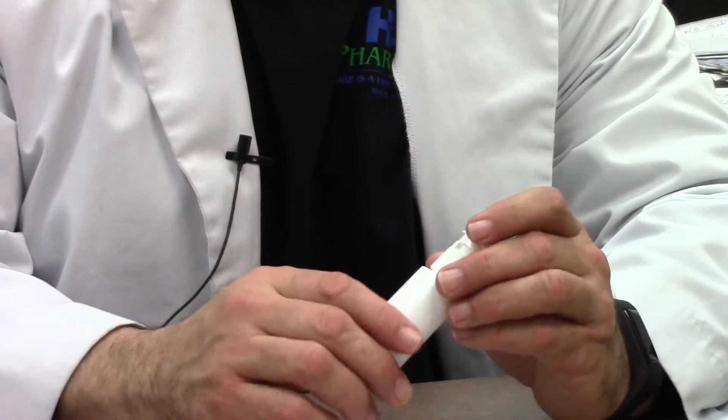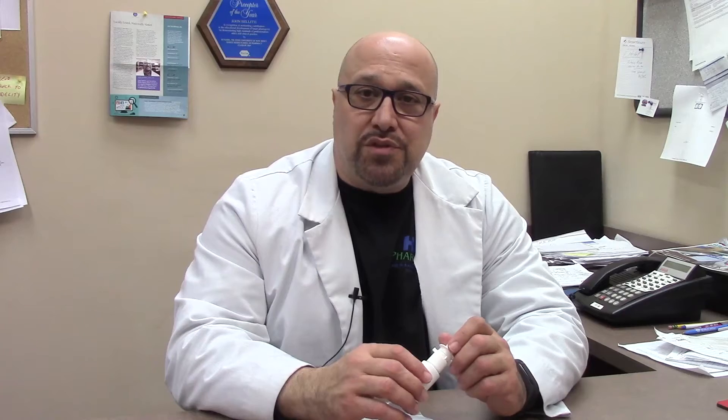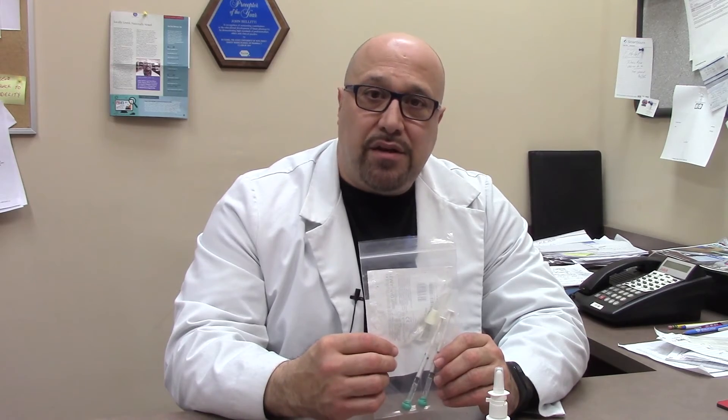Previously, we have been dispensing midazolam nasal spray in this type of bottle, and it was used for emergency situations for seizures lasting usually longer than five minutes. However, we are switching to a new, more effective dispensing system, and today I'm here to talk to you about how to use it.